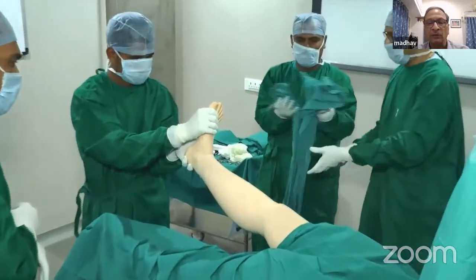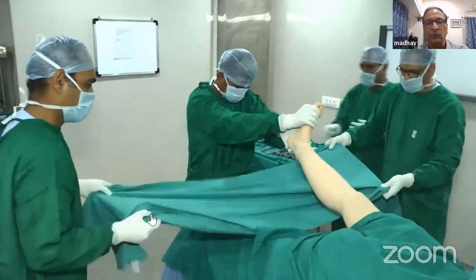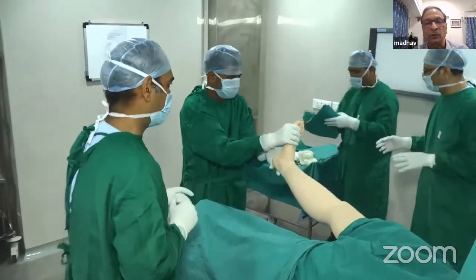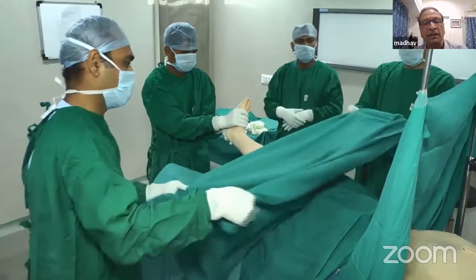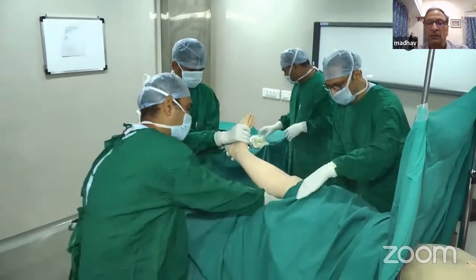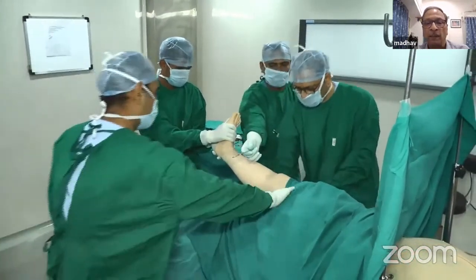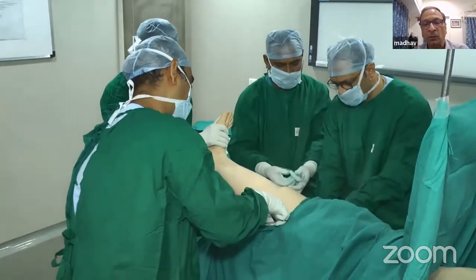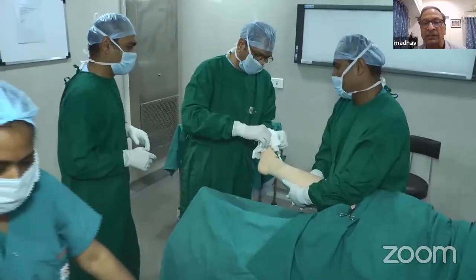So now you have isolated the upper part of the body and the thigh from both the sides, anteriorly and posteriorly. Now take a big sheet and spread it and bring it up to the tourniquet and cover the entire lower part of the table. Let the sheet go right up to the floor to cover the lower part of the table. Nothing should be exposed. Now take one more sheet from the upper side and medially and laterally secure these 2 sheets, one from below and one from above, with towel clips. So now you have 2 layers. The first one was inside and now these 2 sheets you have covered.